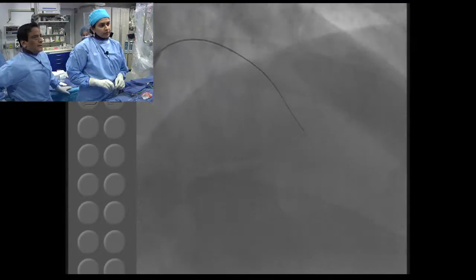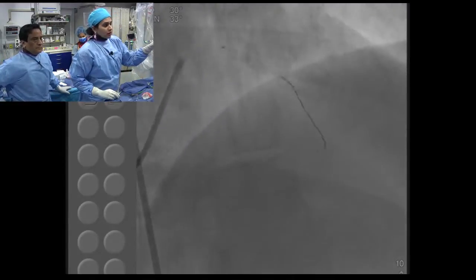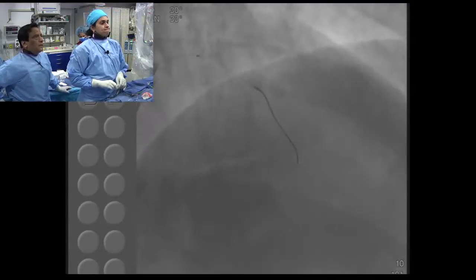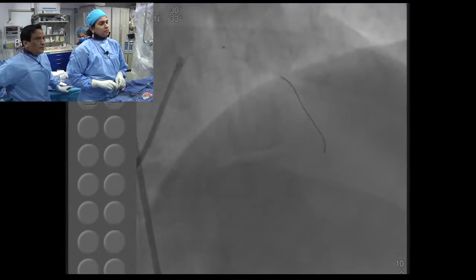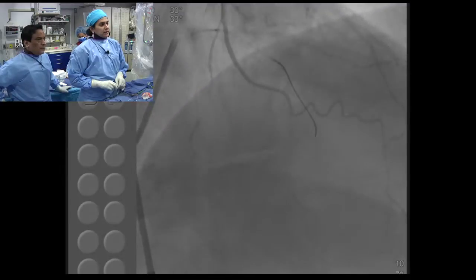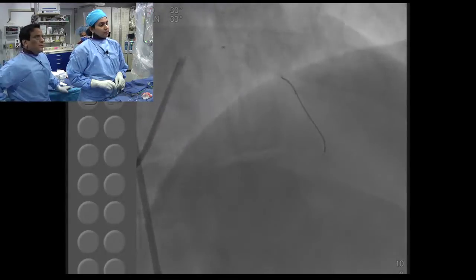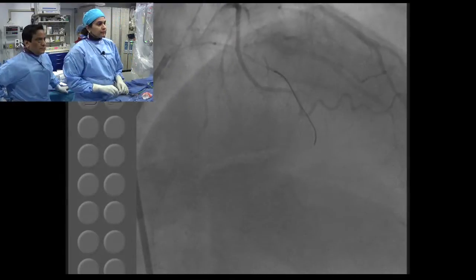See? Yeah. Same. Is it this one? Could this be the LAD, the other septal? So what we are thinking is septal. Where are we in the septal? No. You know what I'm saying? It doesn't look that way. No, I think we just have to make a few other directions, yeah.